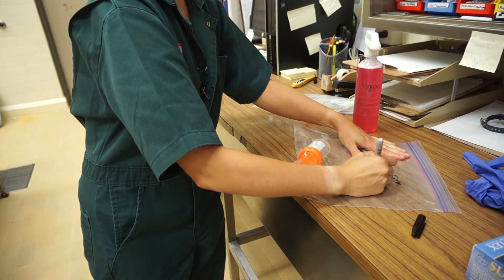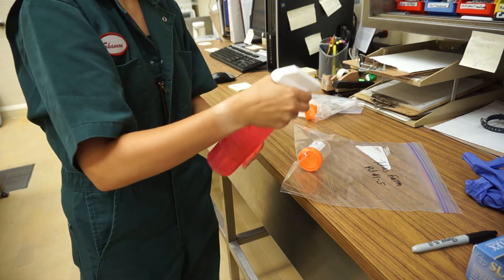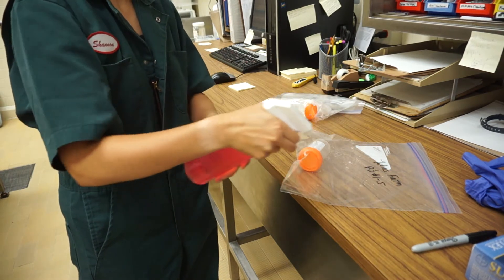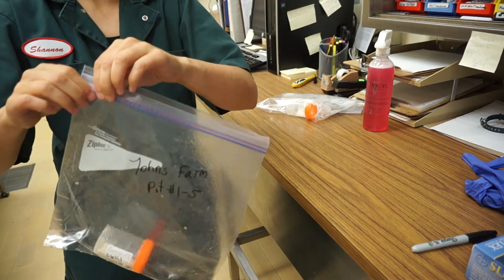If you have more than five pits, use new kits to repeat the process until all manure pits have been sampled at your site. Finally, sanitize the outside of the Ziploc bag before you submit it to your vet or the diagnostic lab.